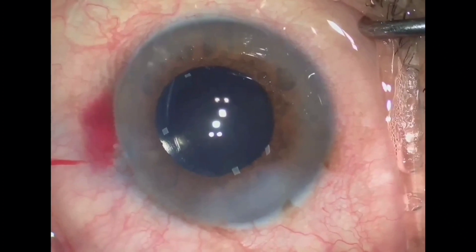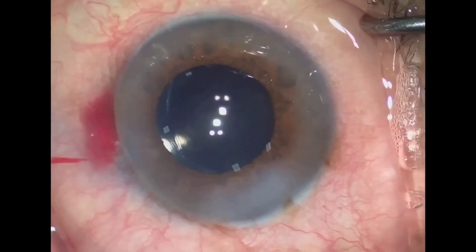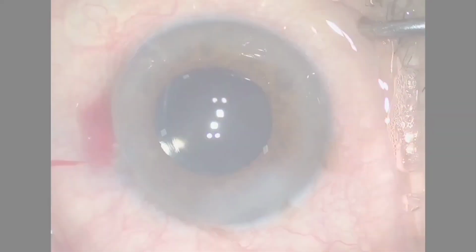Post-operative best-corrected visual acuity was 6/6. Most common modes of management of this complication include needle aspiration technique, which has a risk of engaging the vitreous, and pars plana vitrectomy, which requires posterior segment visualization.